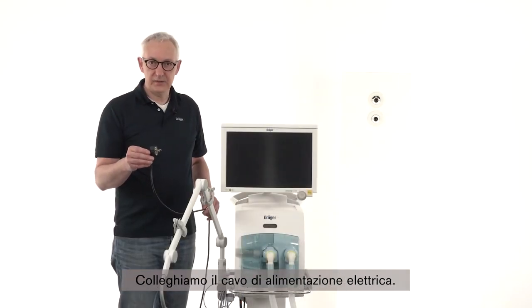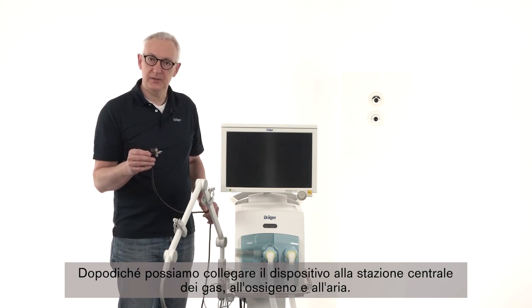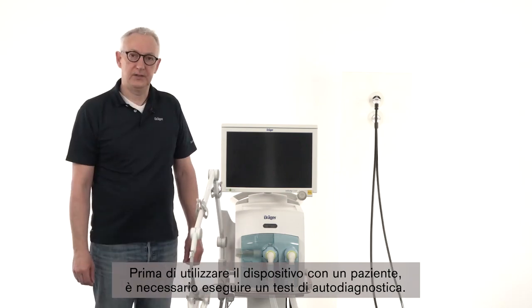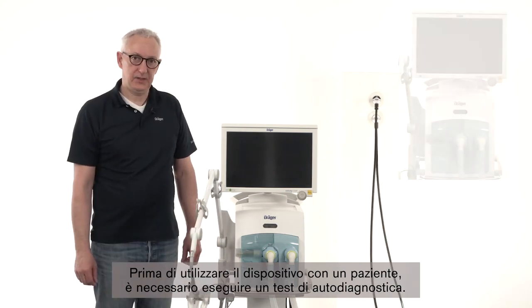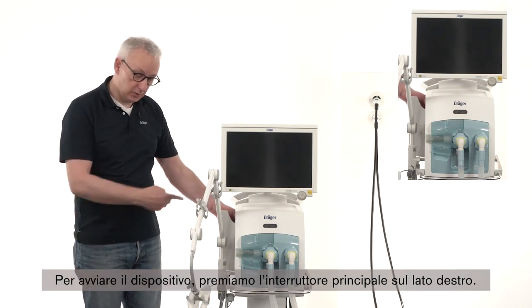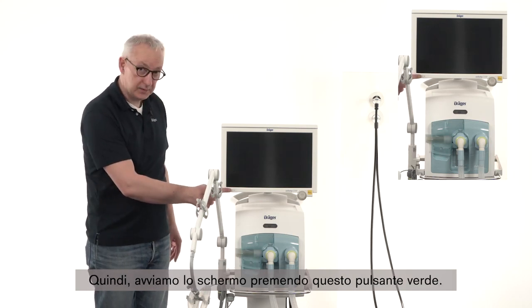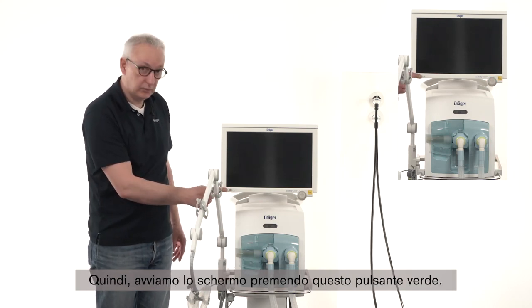Connect your main electricity cable, and after that you can connect the device to the central gas station — oxygen and air. Before you connect the device to your patient, a self-test is needed. To start the device, switch on the main switch on the right side of the device. After that, start the screen with the green knob.